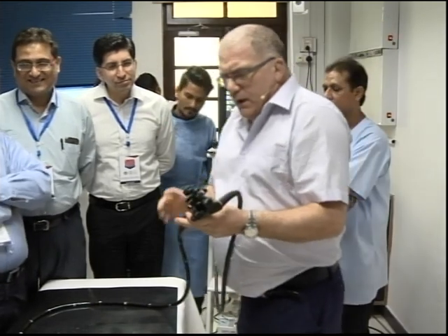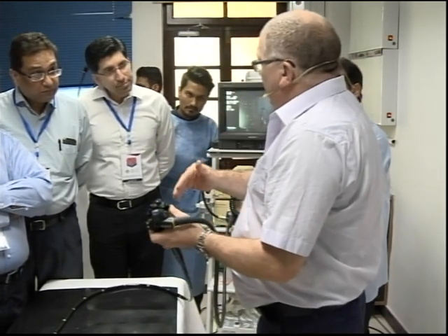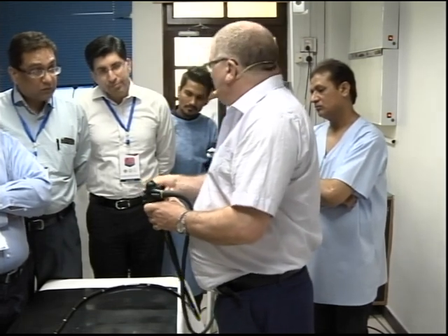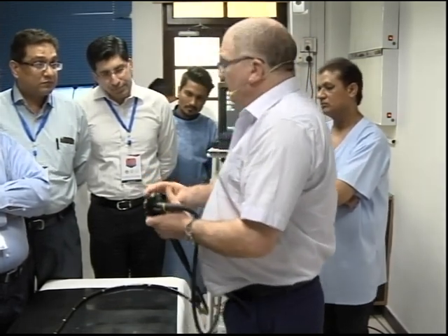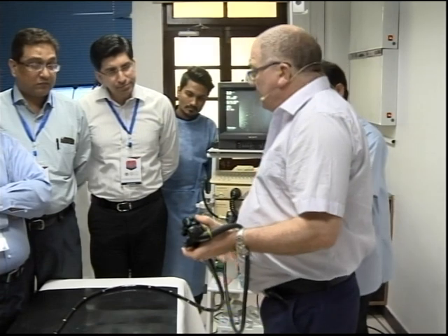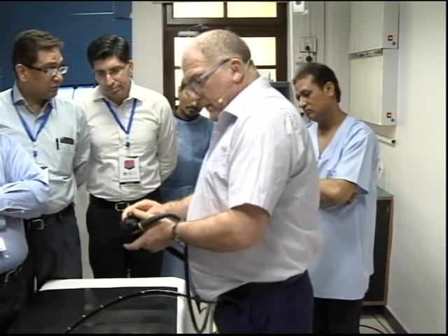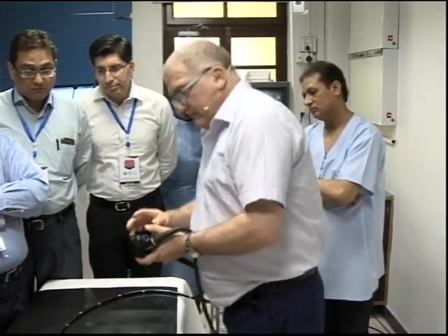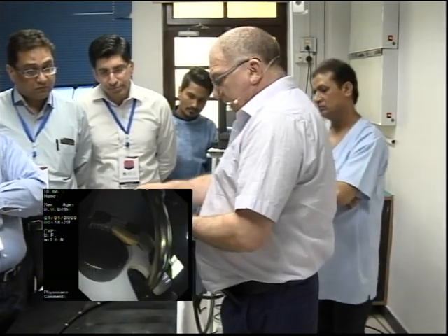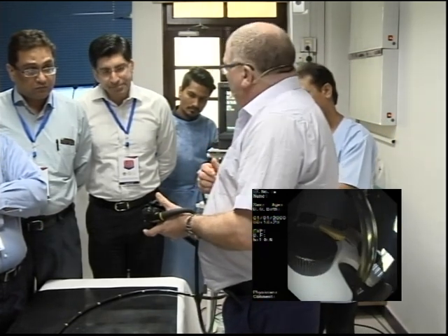What happens is that a lot of people use these, and in the early generation of scopes they would say that it will lock the wheel in a position that enables us to do something. I never use them. I want that scope, I've drawn the big wheel back. This is what I'm going to look at. So I look at it with the wheels, I move the wheels, then I lock the wheels in position. I hope it stays in position. All that's done is lock the tip.